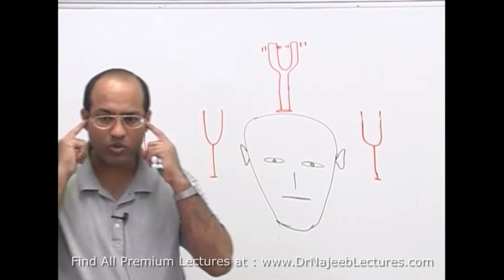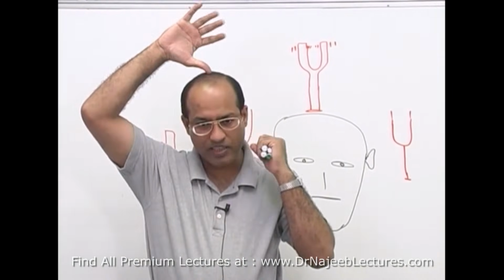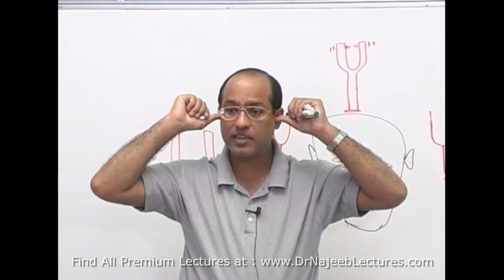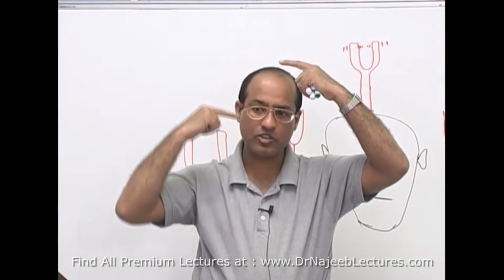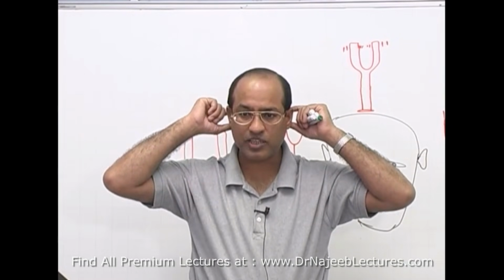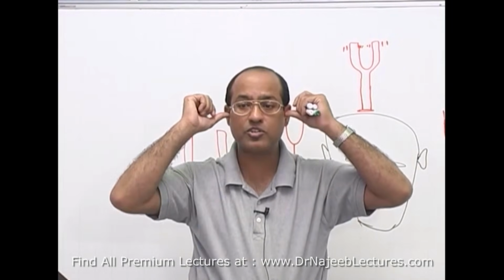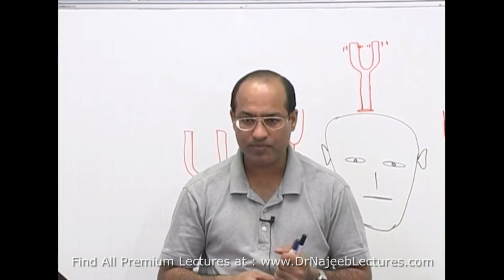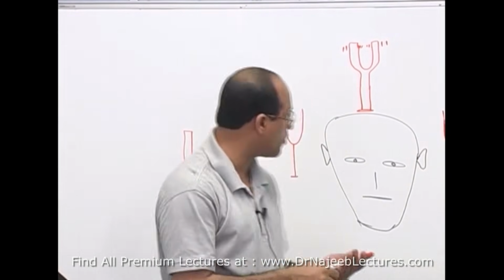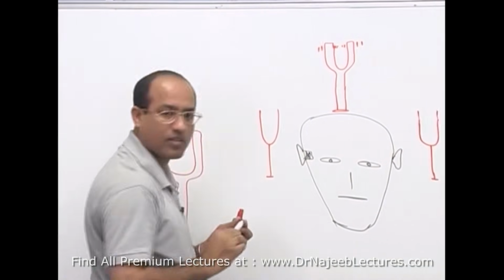If you have an absolutely normal system and you produce a vibrating tuning fork here, it will be heard on both sides equally. So we say normally, because sound conduction on this side and this side is the same and the sensory neural system is also healthy on both sides and working equally well, sound will be equally heard on both sides, so there is no lateralization.